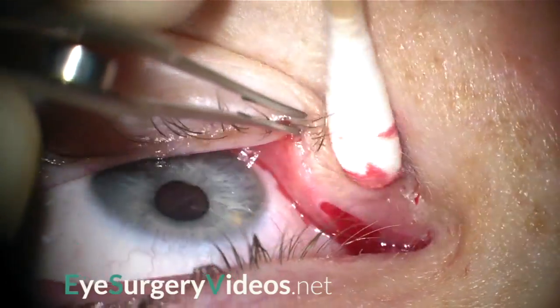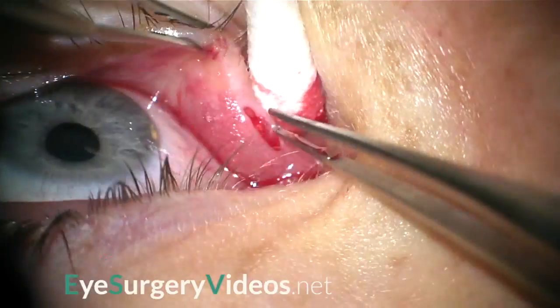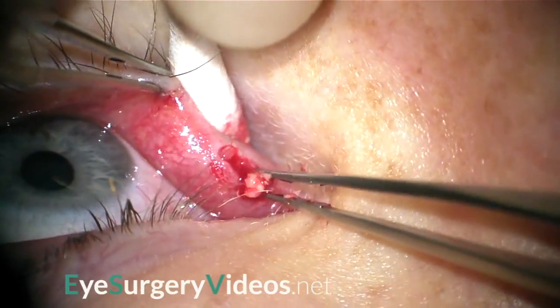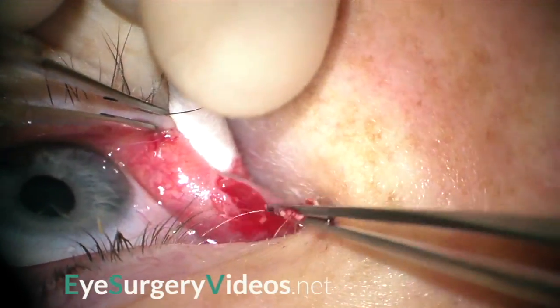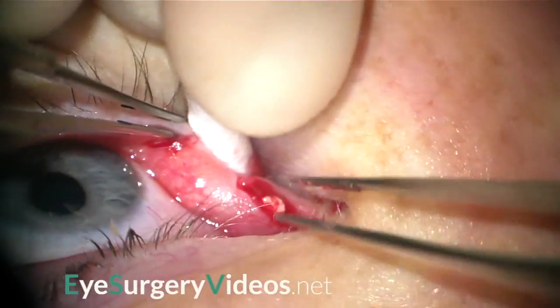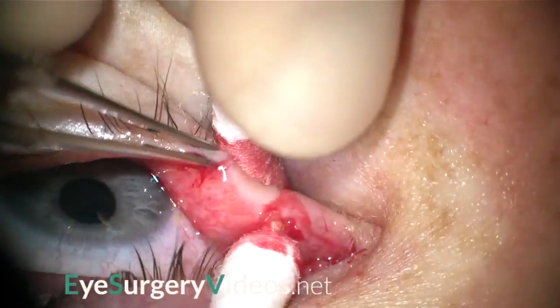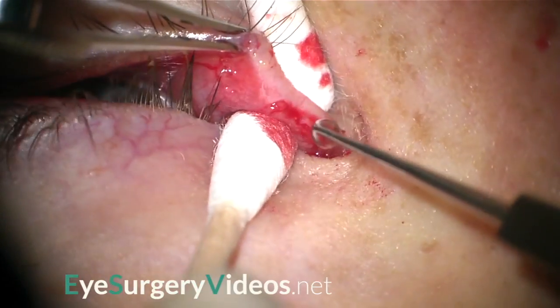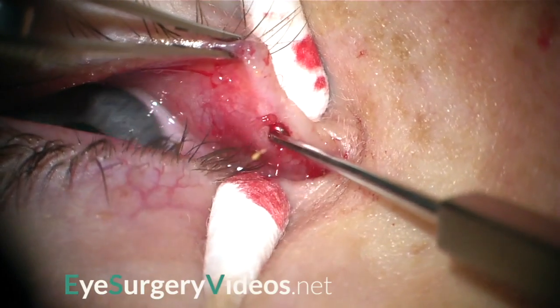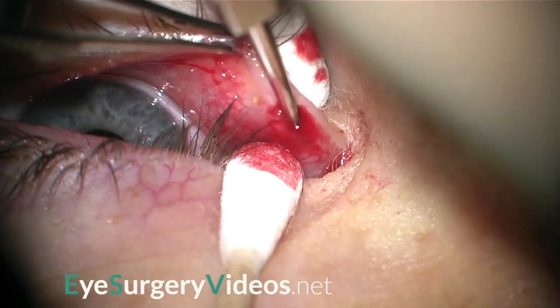The canaliculus is often grossly enlarged and almost cavernous, with much more material than meets the eye. Here we use a curette to ensure complete evacuation of all material from the inferior canaliculus.